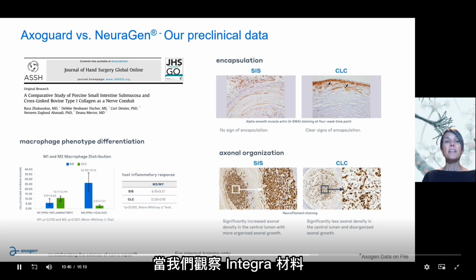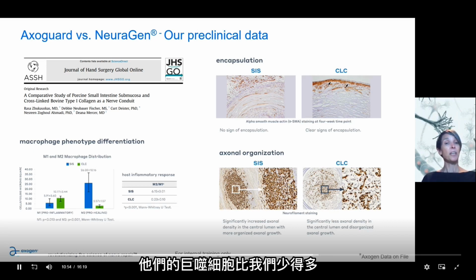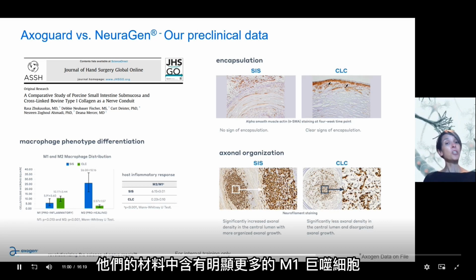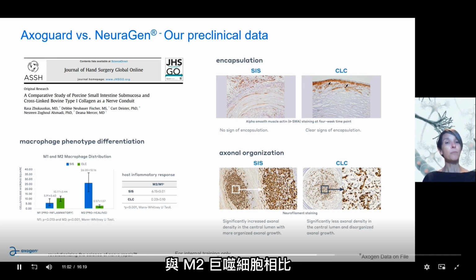And when we looked at the Integra material, the Neurogen material, yes, they had significantly fewer macrophages than we did. But when we look at the type of macrophages, they had significantly more M1 macrophages in their material than they did M2 macrophages.